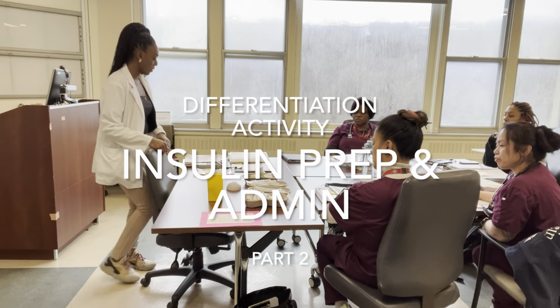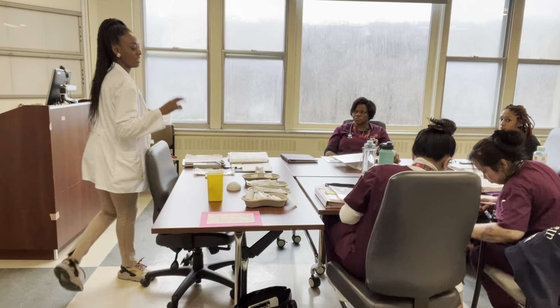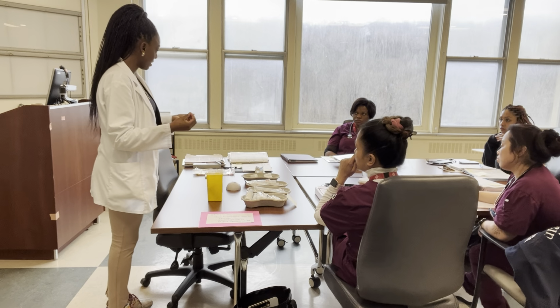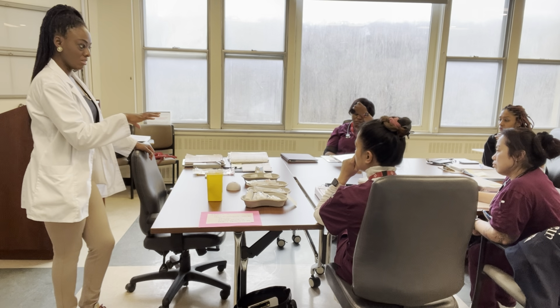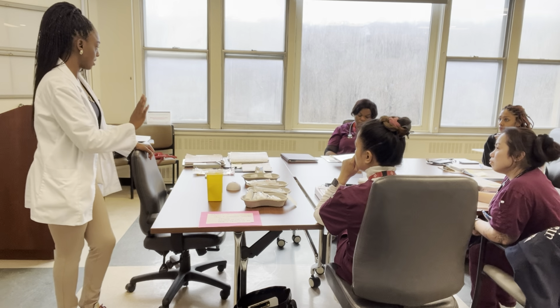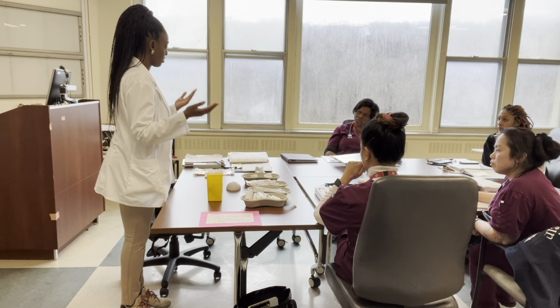Alrighty, ladies. So what we'll do is continue the second half of the process, which I mentioned to you all, which was the actual fourth station, administration. Basically preparing and then administering the insulin to your patients. Correct? So you all learned how to use the protocol. You understand how to select your insulins. Correct? Which type? Am I on the right page? Are we good? So I'll do the next demonstration, and then you will practice it yourselves.